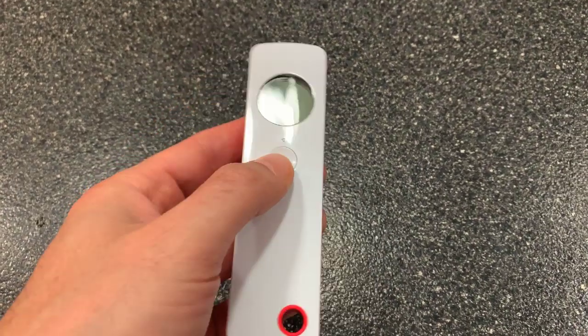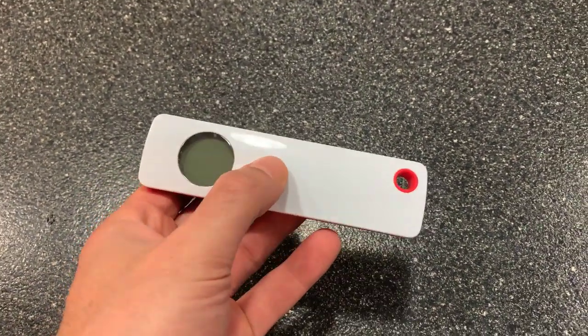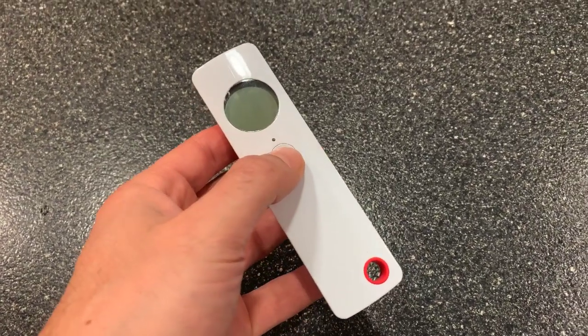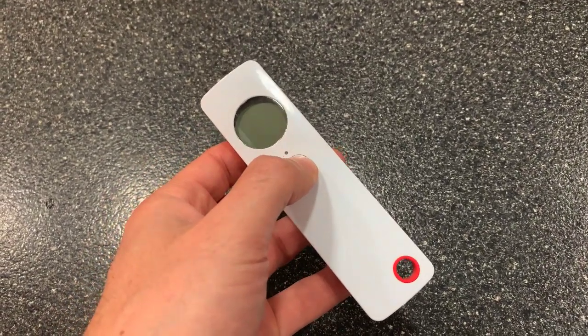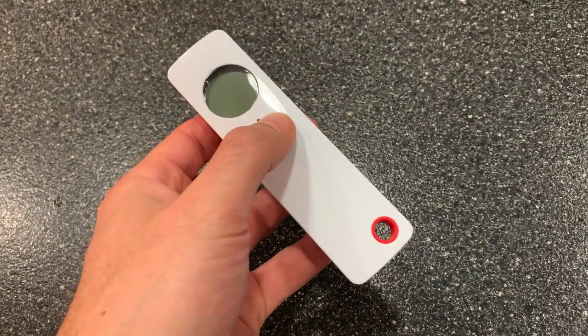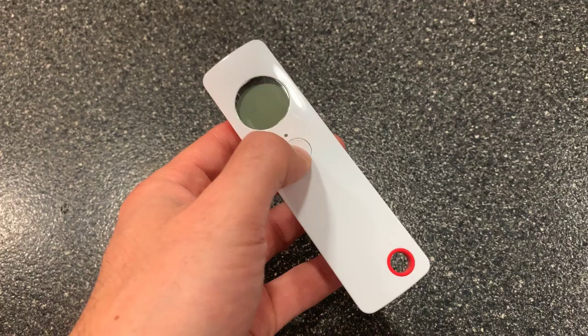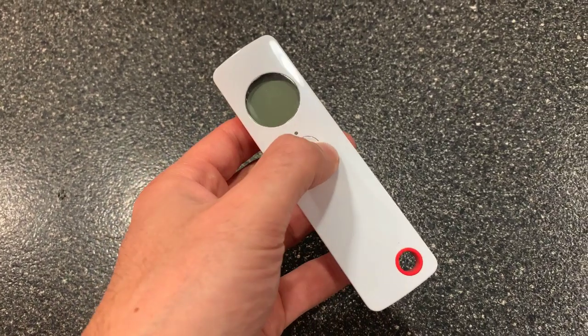This thing is really cool. Long gone are the days of shaking the thermometer and squinting with your eyes to see where the mercury is and holding it under your tongue when you're sick.